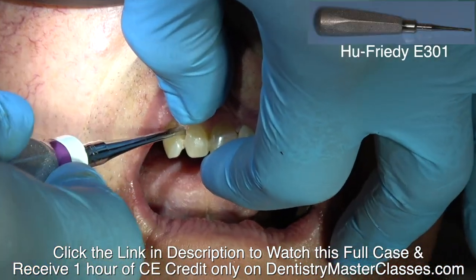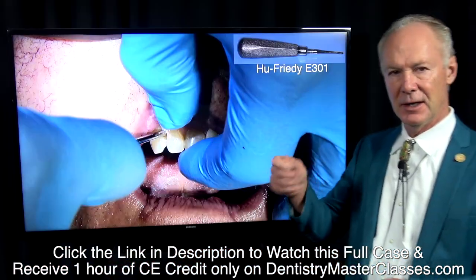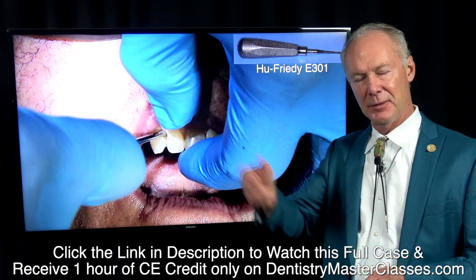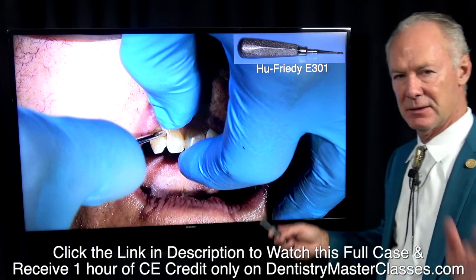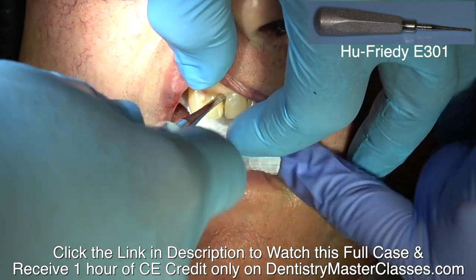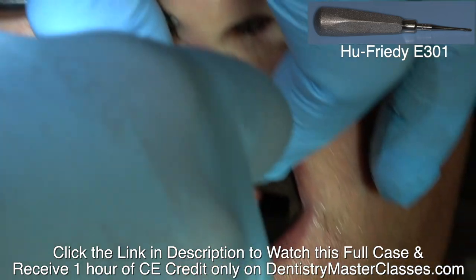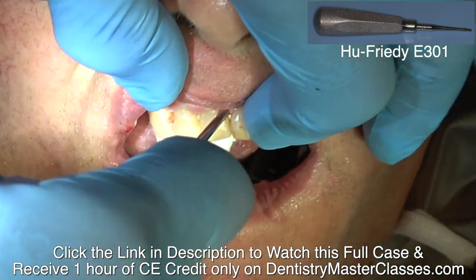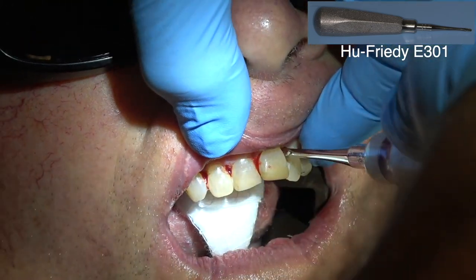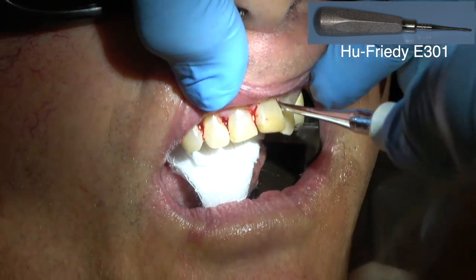Before you try to remove these anterior teeth, if they're pretty solid, see if you can elevate them mesial-distally. If you can and get a little blood in the periodontal ligament space, it makes it so much easier to elevate those teeth, especially the cuspid teeth. When removing teeth from cuspid to cuspid, you want to basically unscrew them — unscrew them to the mesial. You can rotate mesial and distally, but it's just like a screw: you just unscrew them.